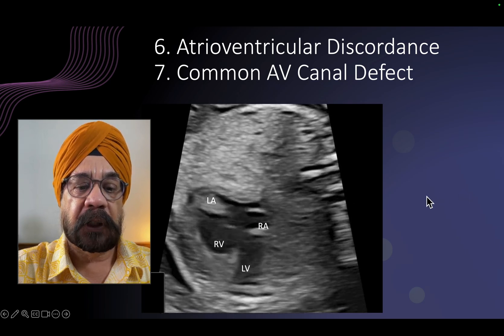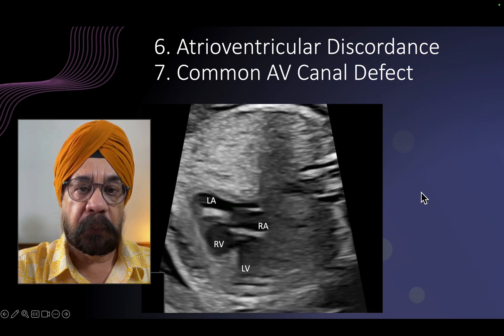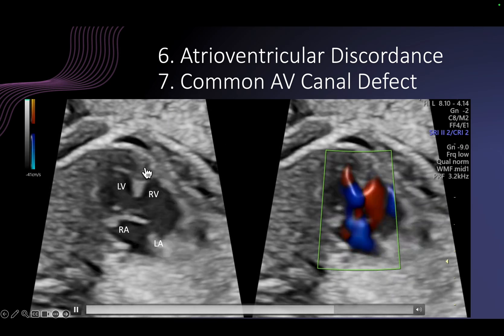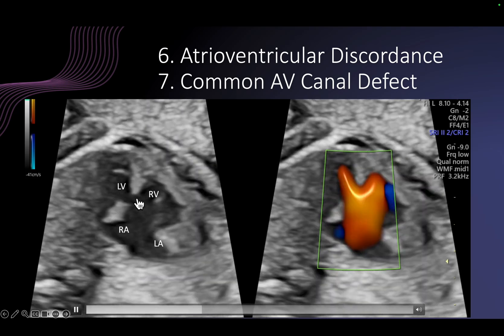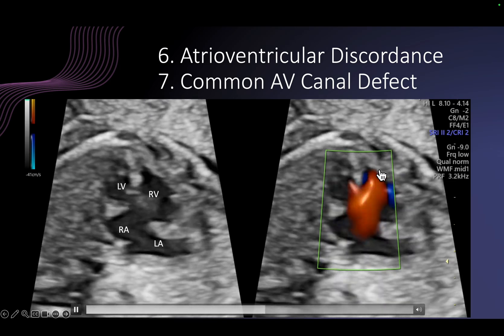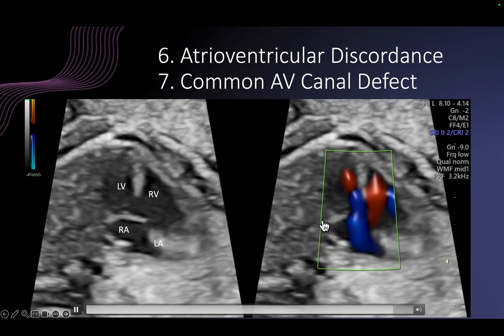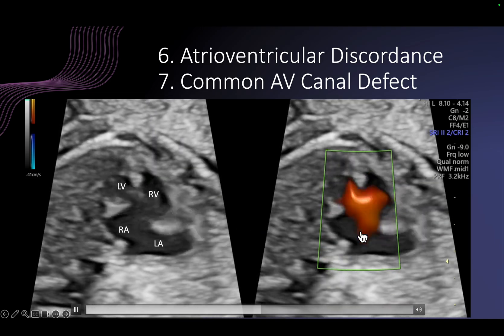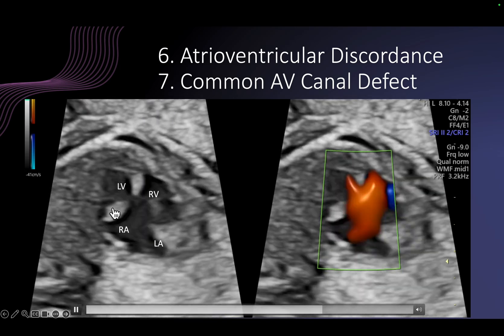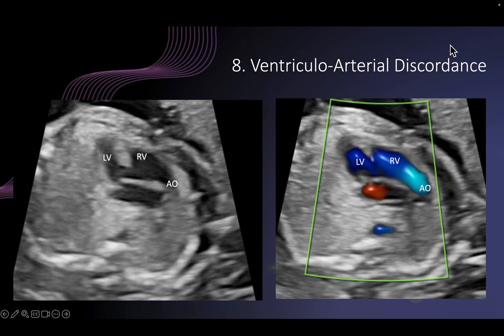Apart from that, we have to describe the AV junction. The AV valve is a single AV valve — this is a common AV canal defect, where you see the interventricular septal defect and the large common AV valve. Color Doppler shows the right ventricle is larger and the flow in the right ventricle is more, indicating a slight imbalance in the AV canal defect. You see the regurgitation right in the middle — central regurgitation — a hallmark of common AV canal defect.